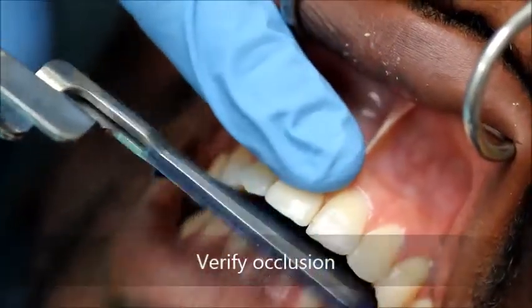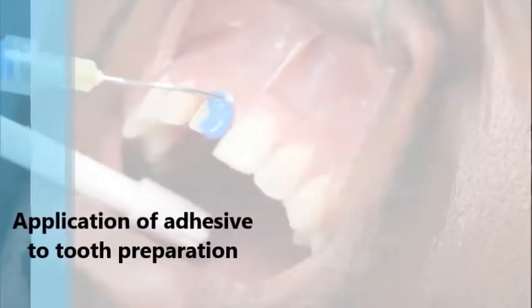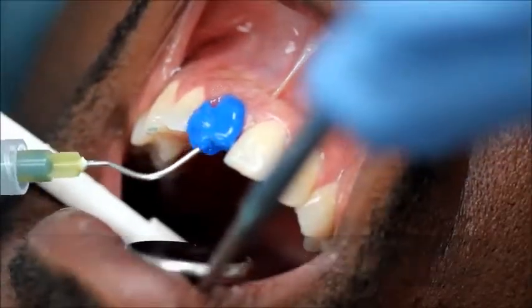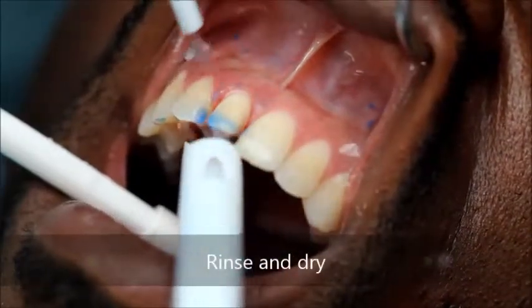Occlusion is examined and the crown is then cleaned with water. The tooth is now prepared for bonding using a total etch adhesive technique. The tooth is etched for 15 seconds with 37% phosphoric acid, then rinsed and lightly air dried without desiccating the dentin.